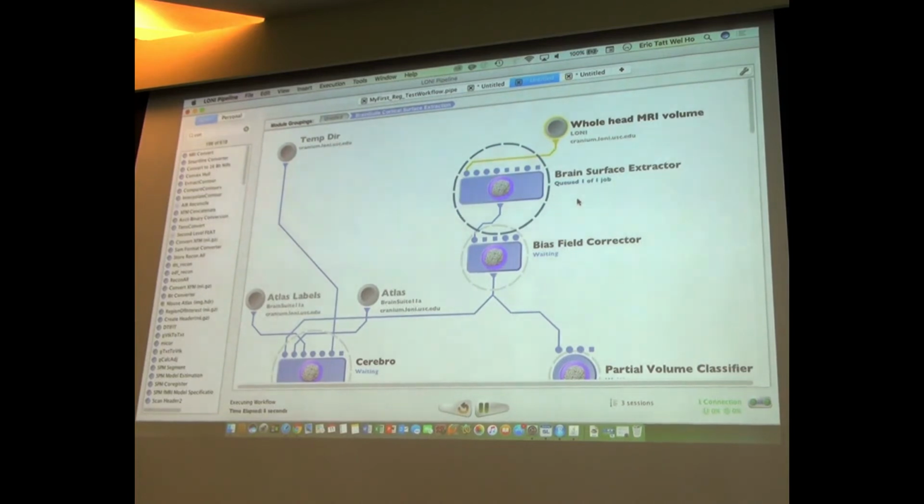But it generates a really beautiful cortical surface representation that you can visualize, obviously, by dragging it into the brain viewer, or you can compute various things on it. For example, the curvature, fractal dimension, surface area, all kinds of things. These are derived neuroimaging biomarkers that you can compute on the cortical surface.